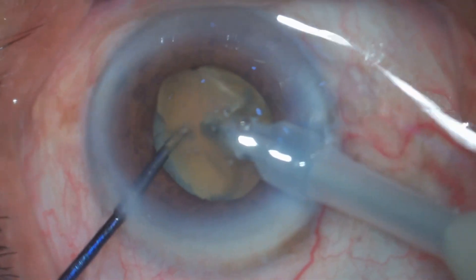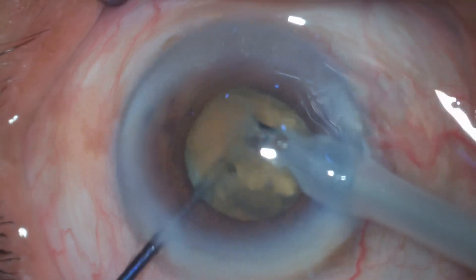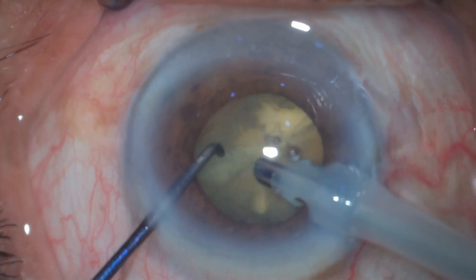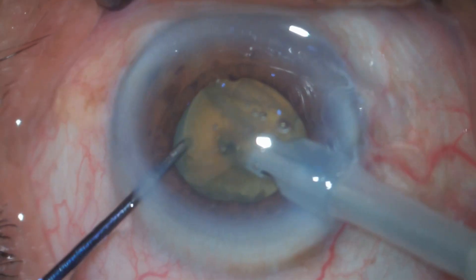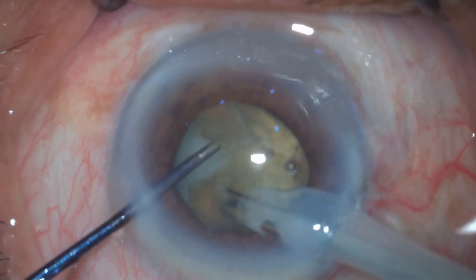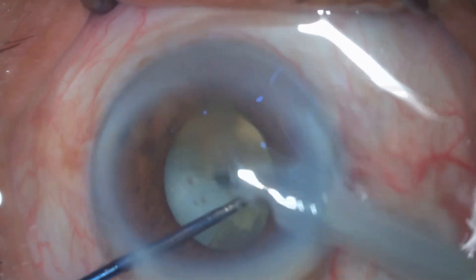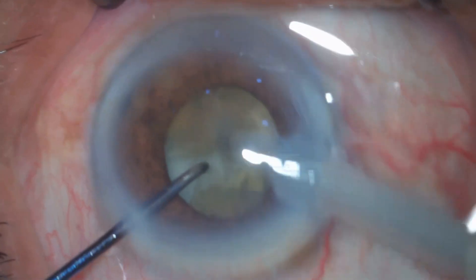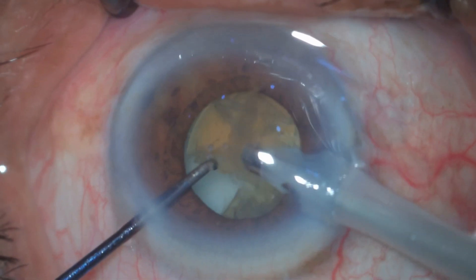Now it's time for the petals — the epi nucleus petals — as I have created a kind of flower shape. I'm separating these petals one by one from the posterior plate. Now it's very easy to separate these petals from the posterior plate as the nucleus is hardly having any bulk remaining.